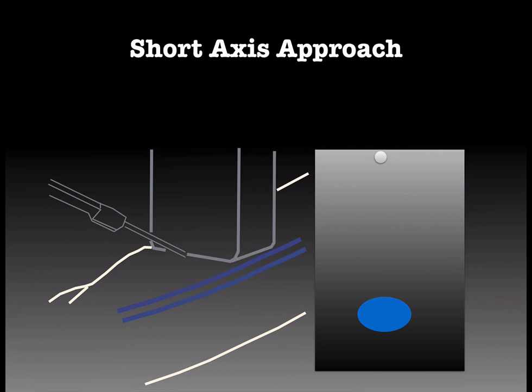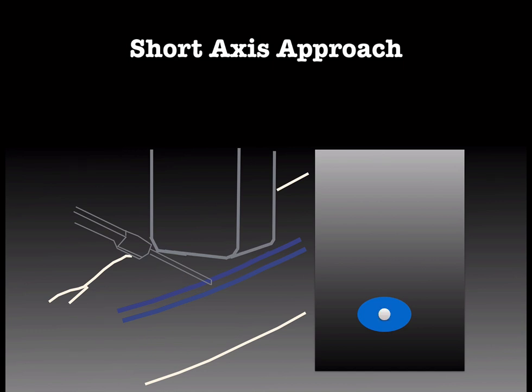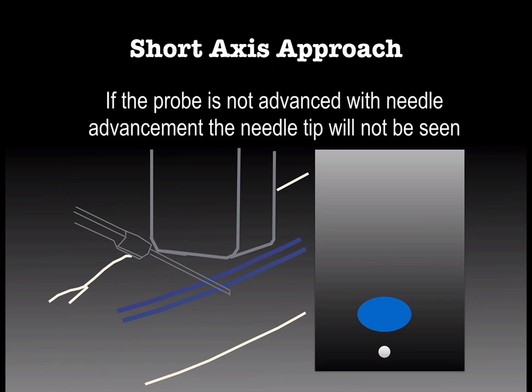If you don't move the probe, the picture's not going to change. So here we are, we're set up, we're directly over the vein. We advance our needle, the picture did not change. This gives people a false sense of confidence and the needle keeps on going deeper in the tissue, and you may hit the vein and you may get a flash of blood, but more than likely you will go out the back wall of the vein and then your wire won't feed. This does not necessarily cause a lot of complications. However, it could be another structure, like an artery sitting back there, and you think you're in the vein, but you're really in the artery, and then you proceed with the procedure and have a bad outcome.